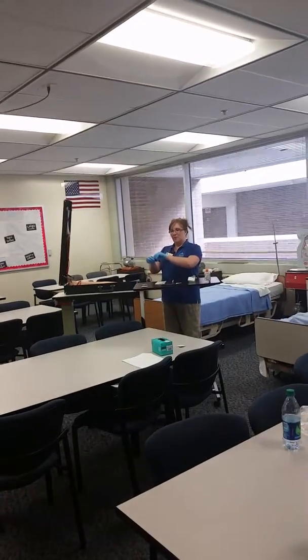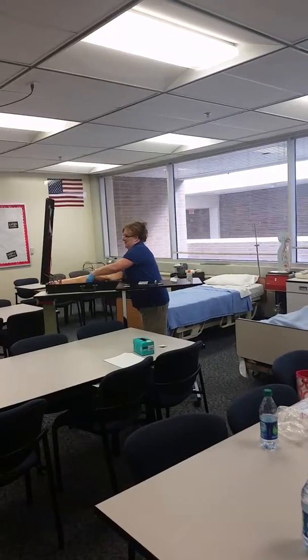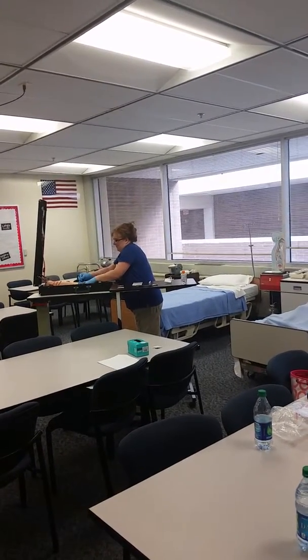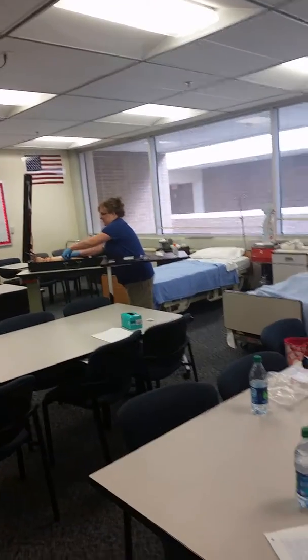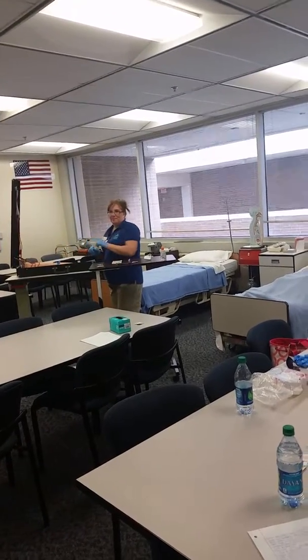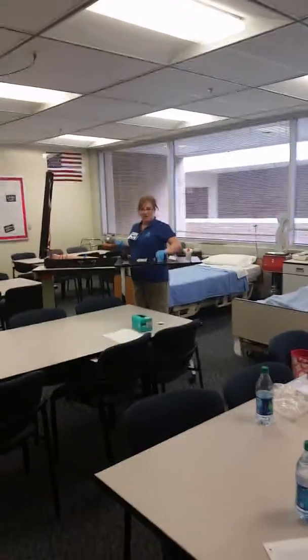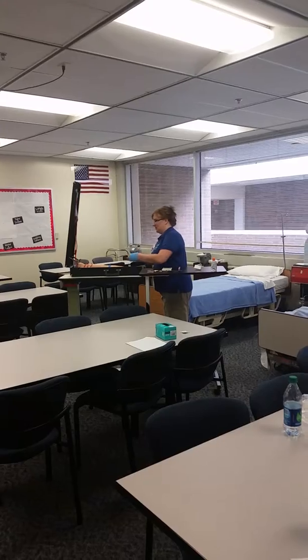Okay. I will now apply my tourniquet 4 to 6 inches above the site. Check for a radial pulse. Okay, now I'm going to clean the site using an alcohol wipe, and I will wipe in concentric circles.